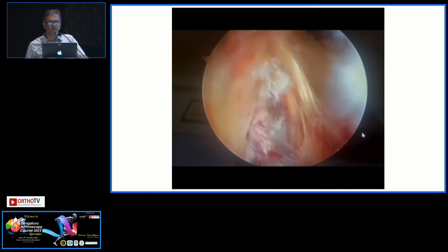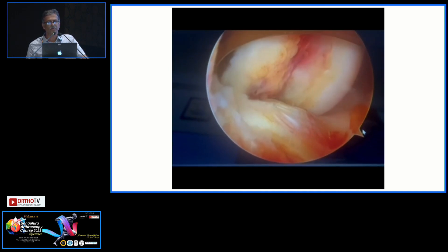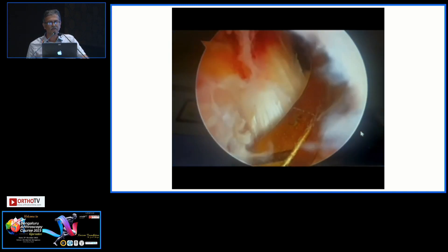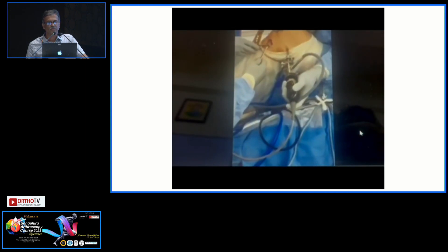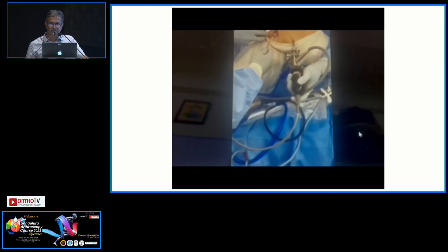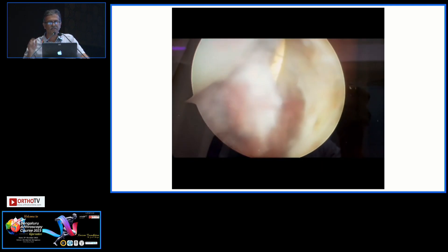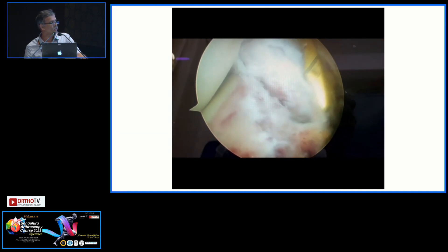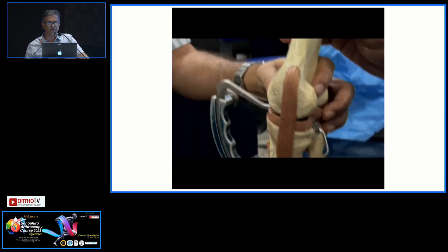From the posteromedial portal you make your entry, and the jig is inserted through window 2 — that is, between the ACL and PCL. You take the jig from there. Then you visualize from the posteromedial portal, and this is the jig which is manipulating the fragment. You can appreciate the fragment there as I try to reduce it, and this demonstrates how the tunnels are drilled.